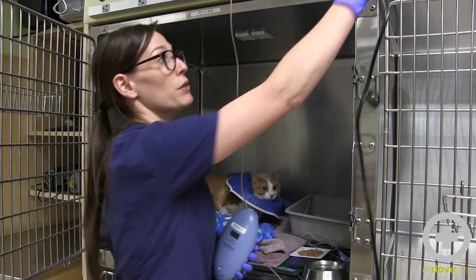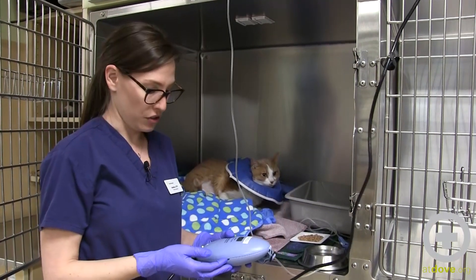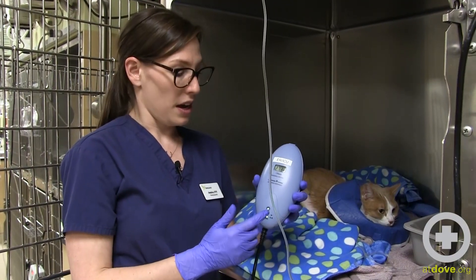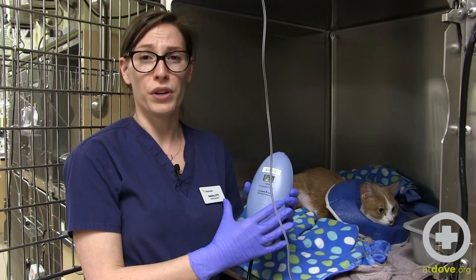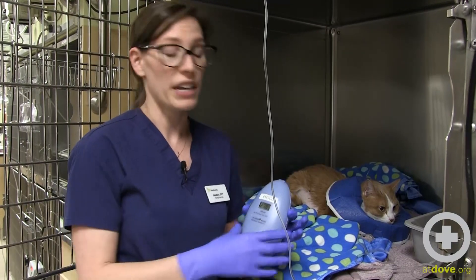First you will want to plug in your fluid warmer, and it will alarm just to let you know that it's starting to work. After you've plugged it in, you will notice that it says 'run' and the light is lighting up. Once it reaches the maximum temperature — in this case 41 degrees Celsius or 105 degrees Fahrenheit — the run will turn off, and when it drops below a certain degree, it will start warming again.